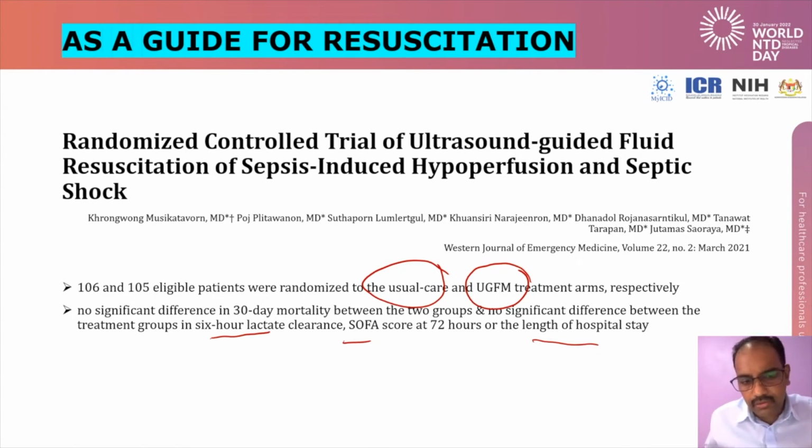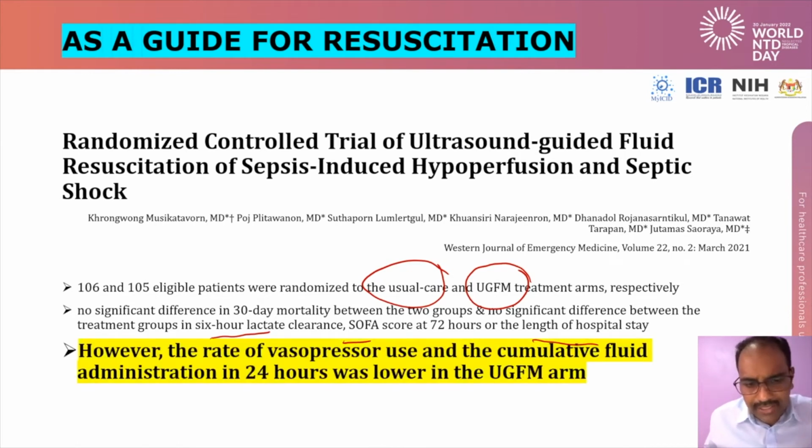But when I look into detail on this paper, the rate of vasopressor, that means inotropic support, and the cumulative fluid administration over 24 hours was lower in the ultrasound guided fluid management arm. This is a similar experience that I have when I use ultrasound in managing patients, where it helps me to avoid over resuscitating, and it helps me to avoid under resuscitating a patient.